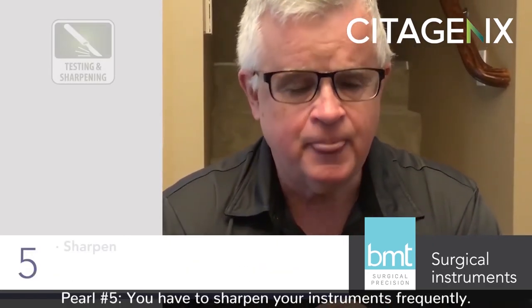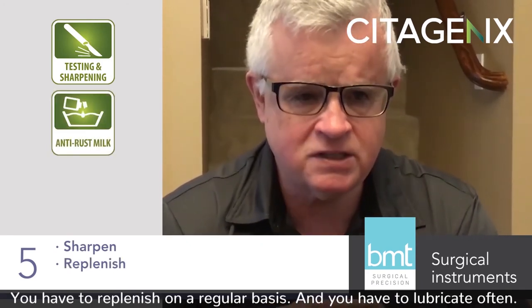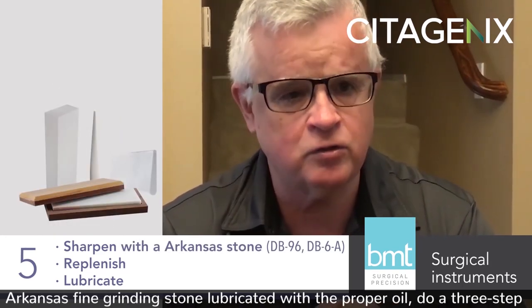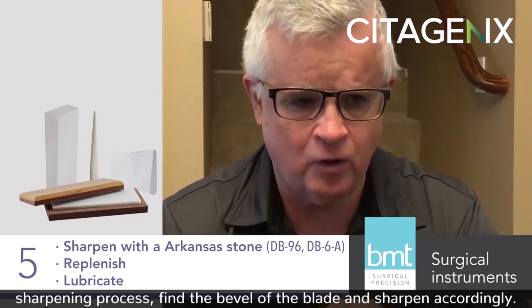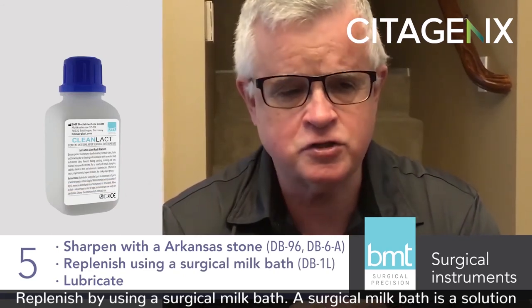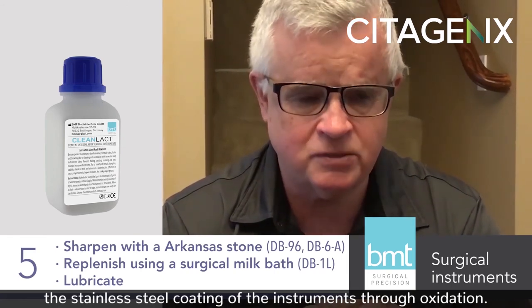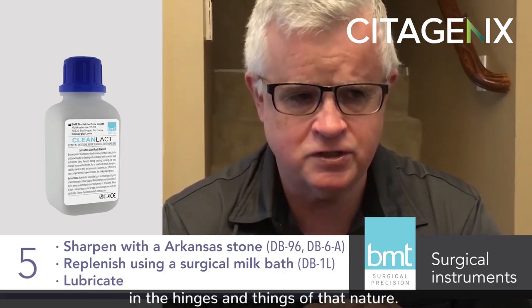Pearl number five: you have to sharpen your instruments frequently, replenish on a regular basis, and lubricate often. For sharpening, use an Arkansas fine grinding stone, lubricate it with the proper oil, do a three-step sharpening process, find the bevel of the blade, and sharpen accordingly. Replenish by using the surgical milk bath — a solution you mix one part to five parts distilled water. Fully immerse your instruments in it. It will replenish the stainless steel coating through oxidization and also help remove all the gunk that accumulates in the hinges.